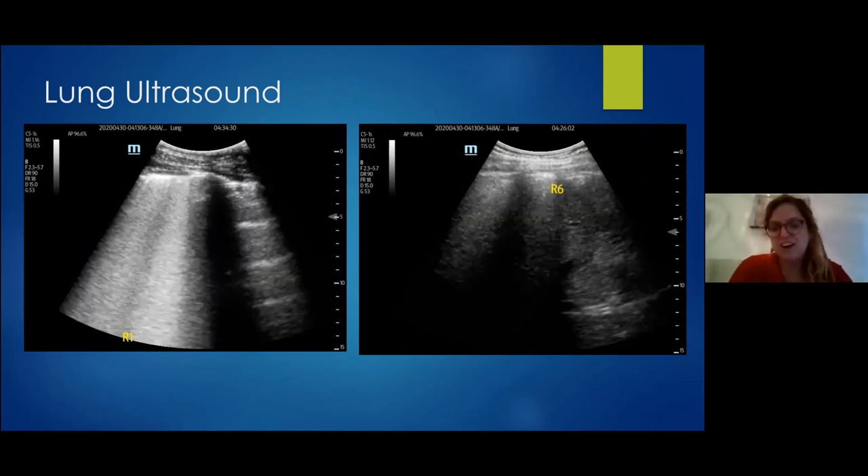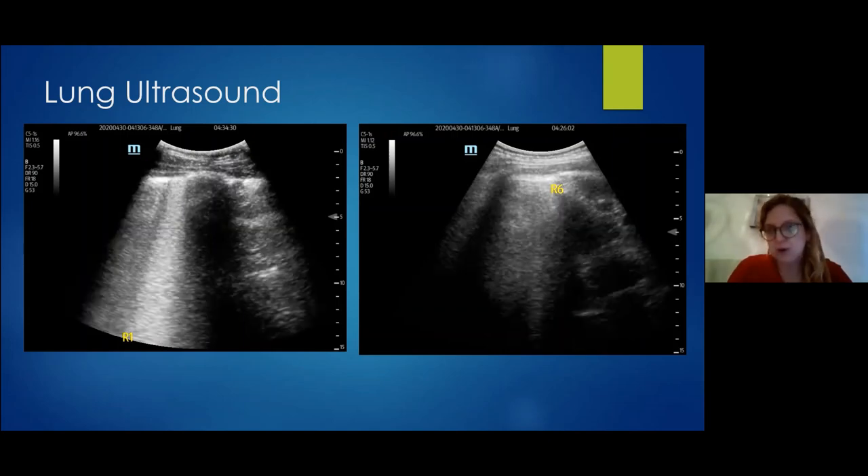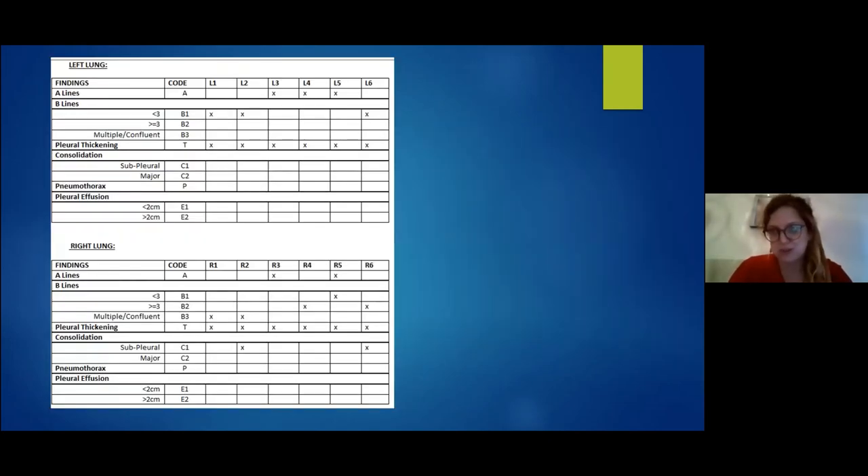We reported all the lung ultrasound — the right lung was more affected than the left. She had pleural thickening throughout, kept some A-lines in a few zones, but mainly had B-line changes. This is the way to report it on the EPR. On echo — here is the parasternal long axis view. From the top: right ventricle, then left ventricle, with the left atrium visible.